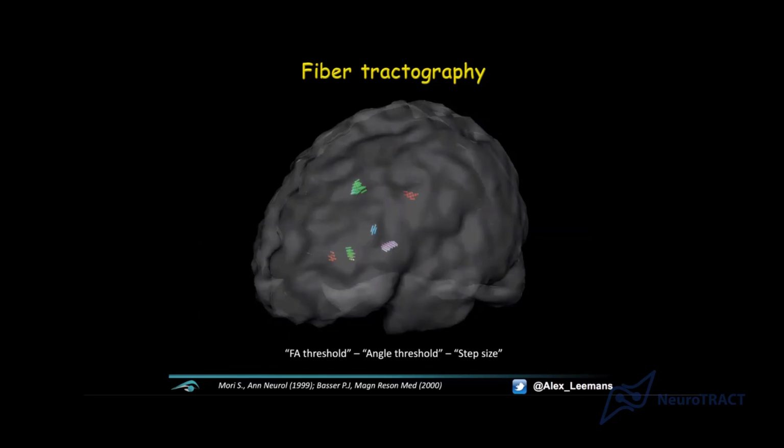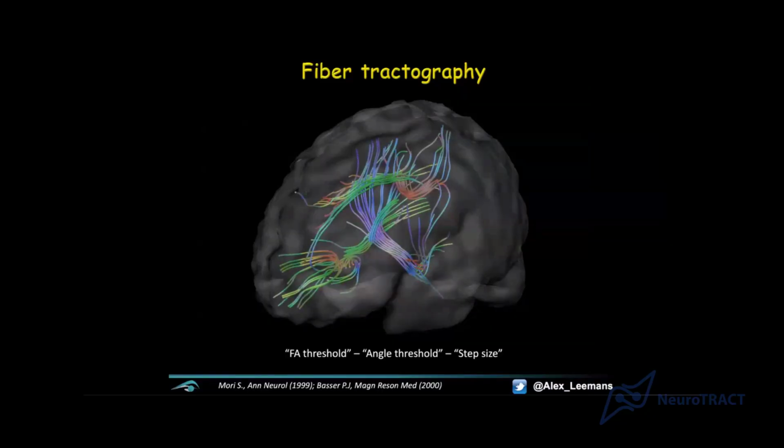By the way, what I'm showing you now is basically the first frame of an animation. So what I'm showing you now is the little start segment. So at these locations, you see the dominant orientations. And if I start the animation, you see that the pathways grow, right? So this is tractography. This is just another visualization showing how pathways propagate.